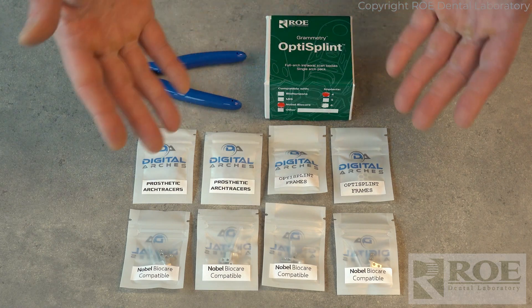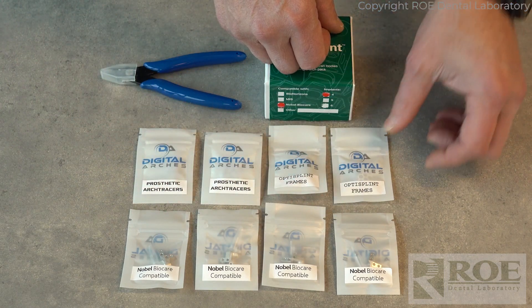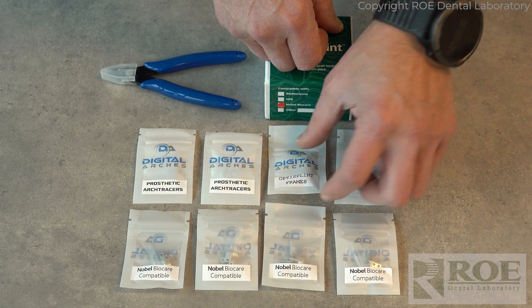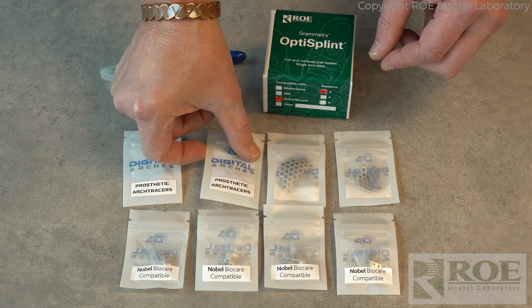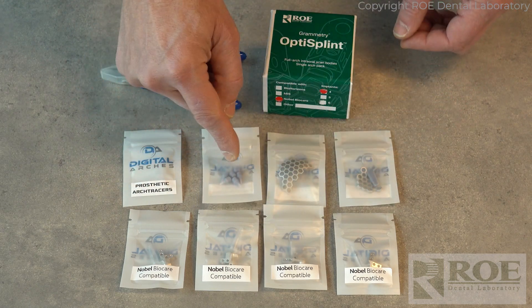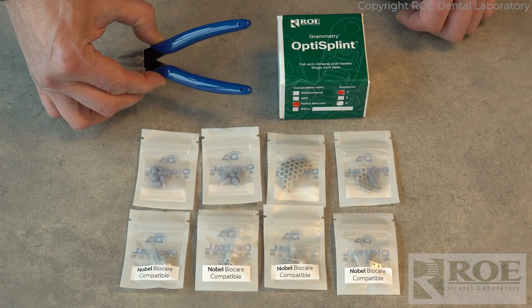When you take the contents out of the box, you'll have four OptiSplints. You'll also have a small frame, a large frame, and these restorative scan bodies — two sets of them — and you'll have some snips.